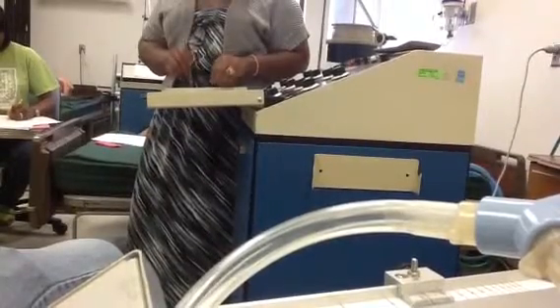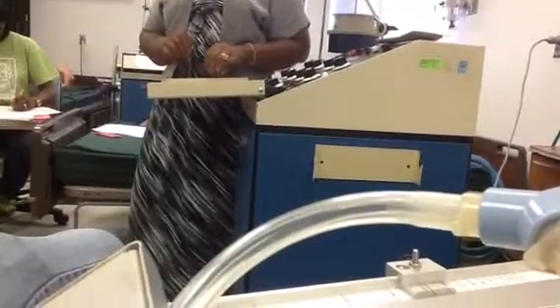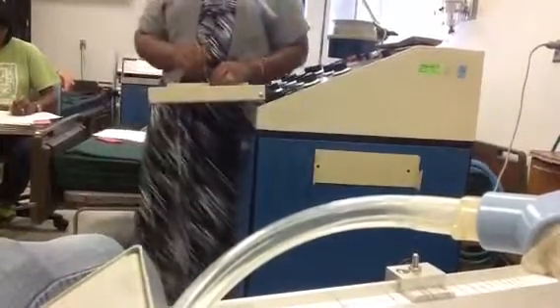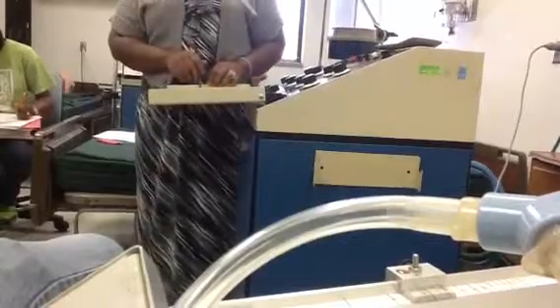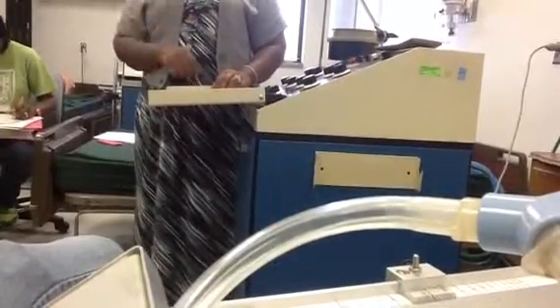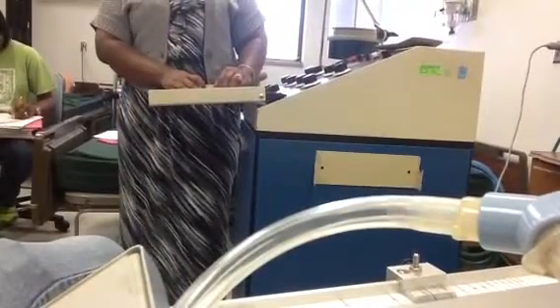What's next? Spontaneous rate. What did I say about spontaneous in AC mode? It's not. Okay, so scratch the line? Exactly. Yeah, I remember doing that part. So X, cross it, shade it in. Yeah, whatever makes you happy. Alright.